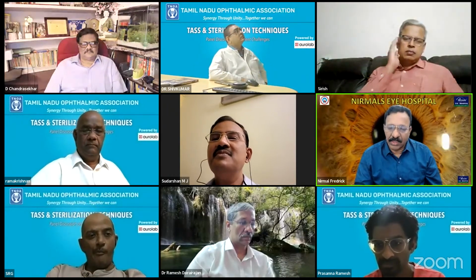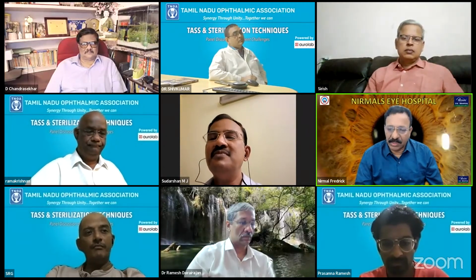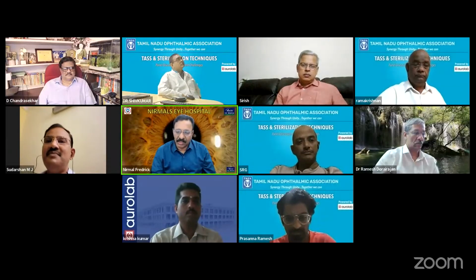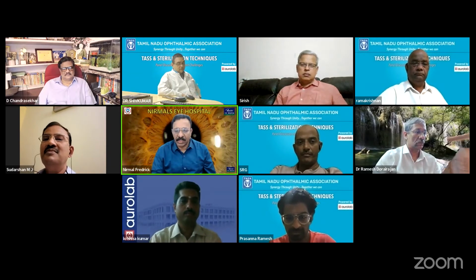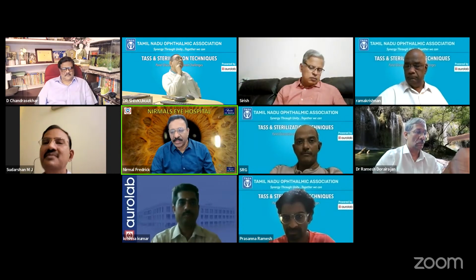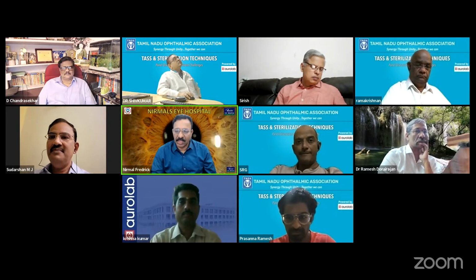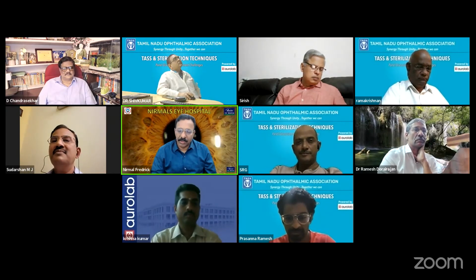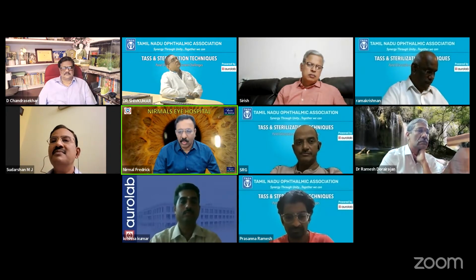So then it was spread over many consumables like the viscoelastic substances, the IOLs, particularly hydrophilic lenses, and the BSS. So these are commonly used intracameral agents or medications. The report was from a wide area across India, as well as from many consumables. And of course, there was one commonality, or in most cases, it was the hydrophilic lenses. Then experts thought it is because of the fluid or the surface or the sterilization. So we wanted to find the root cause.